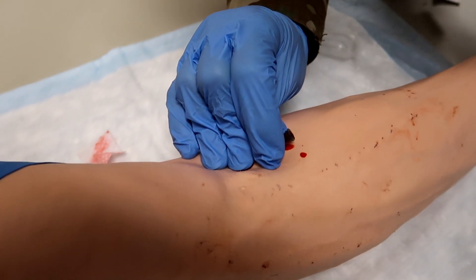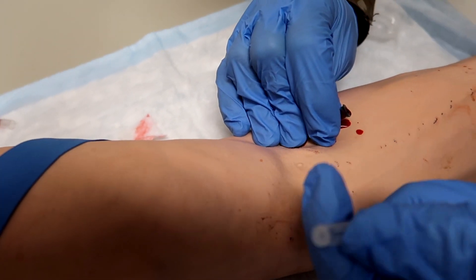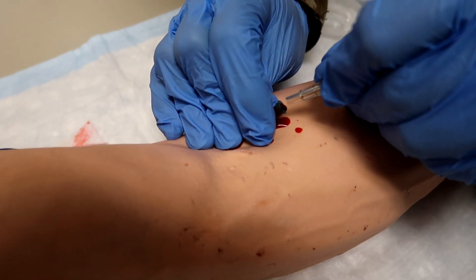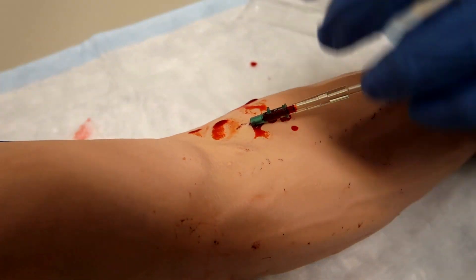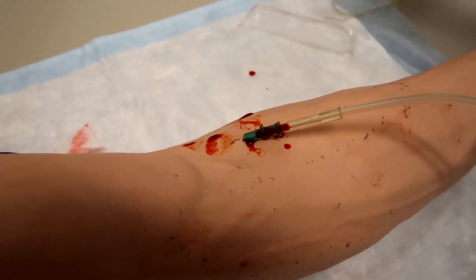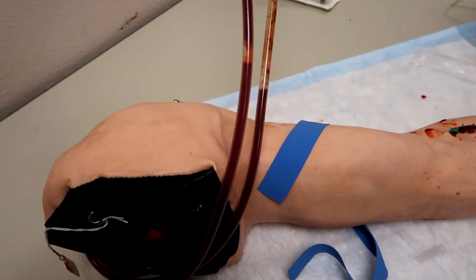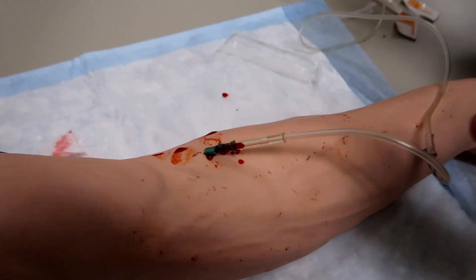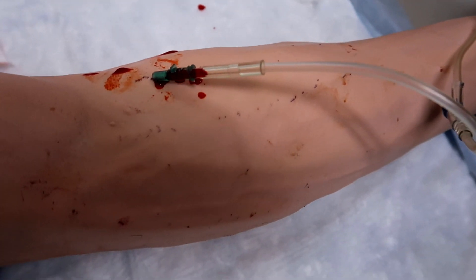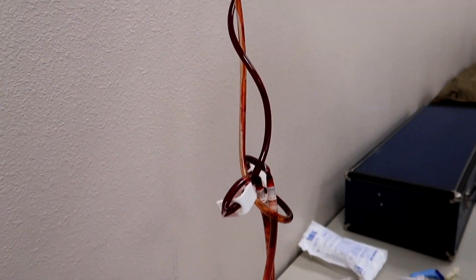Now connect the IV tubing that was prepared earlier, then place a strip of one inch tape over the hub and initiate the flow of fluids. He's connected his IV tubing and now he's going to secure it with one inch tape over the hub and then initiate that flow of fluids. I'm surprised this thing actually bled because I didn't expect it to — I thought it was just a dummy arm, but hey, it works. That's where the blood's coming from right there.